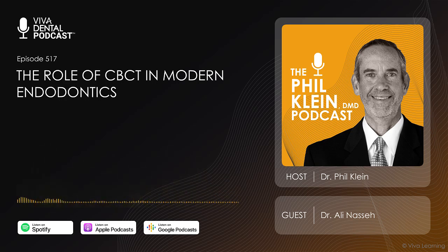When I practiced endo in Philadelphia, I did a lot of retreatments. That was a big part of my day. How does CBCT help an endodontist now when it comes to retreating a tooth? If it's a retreatment, it's going to help you decide whether you should do retreatment versus apicoectomy, because it's going to help you understand if there's a missed canal. You don't want to do an apicoectomy because it doesn't work as well if you don't treat the whole canal. If you have a missed canal, that should be treated non-surgically.